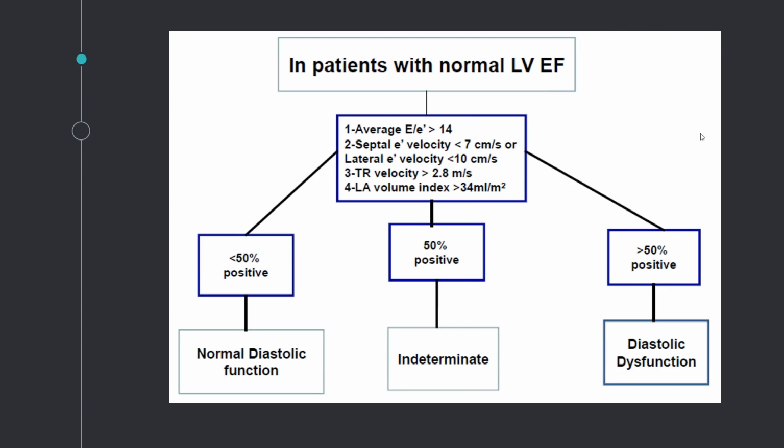So I think on a day-to-day basis, if you find normal diastolic function, you can leave it there. If it's diastolic dysfunction, you often go to the next one to grade on whether it's 1, 2, or 3, and if you have abnormal LVEF, then you go to the next diagram. That's routinely what we do.